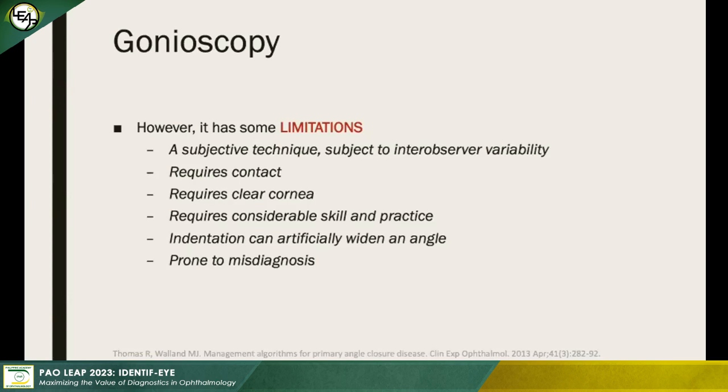As previously discussed, you need a bit of practice and skill for you to be able to perform this well. And if performed incorrectly, indentation can artificially widen that angle. Because of that, it can be prone to misdiagnosis.